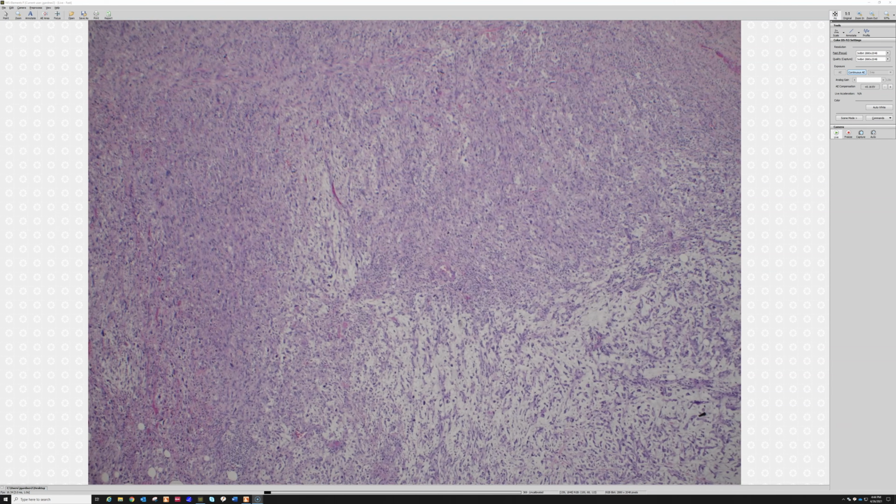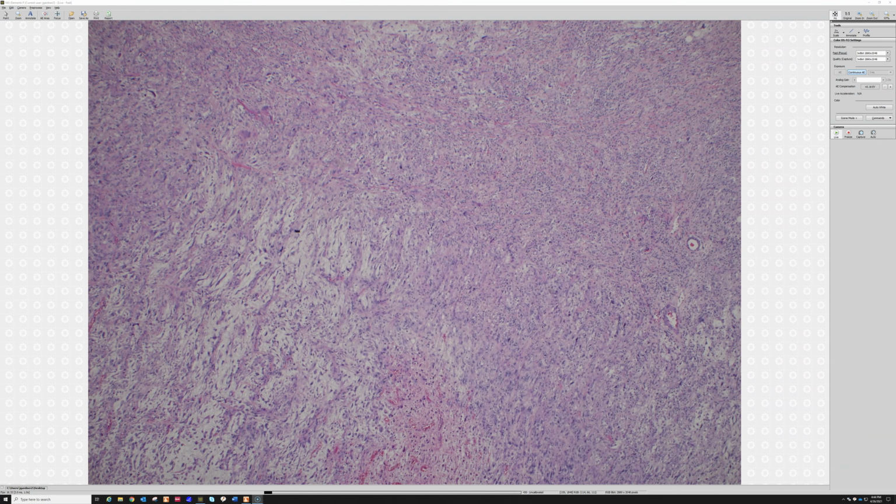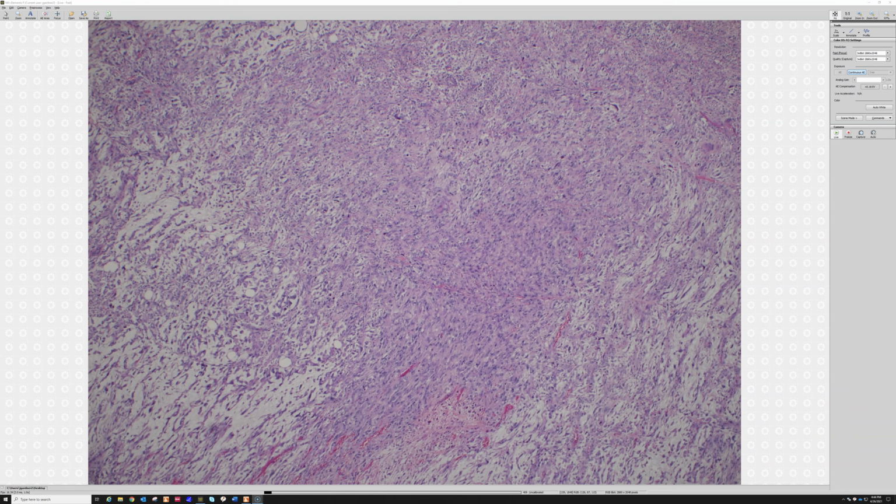These tumors tend to be heterogeneous. They can have areas that are very hypocellular and others that are very cellular. So when it's a large mass and you're getting a needle biopsy and it's myxoid and a little atypical, I will often even mention in my comment that myxoid tumors tend to be heterogeneous, and therefore sampling variation on a small biopsy can be a much bigger concern with myxoid tumors in particular.